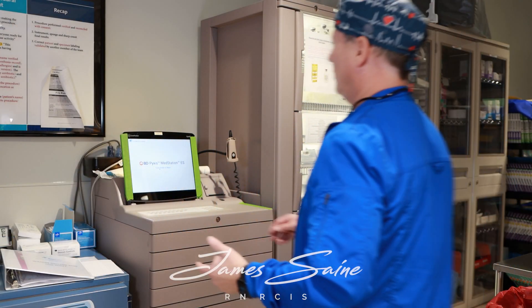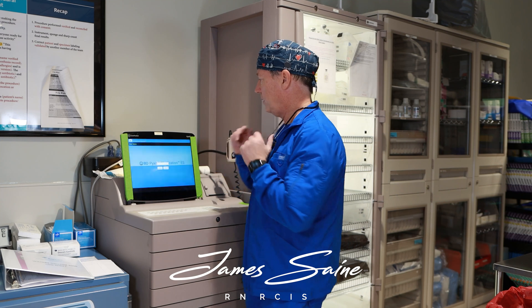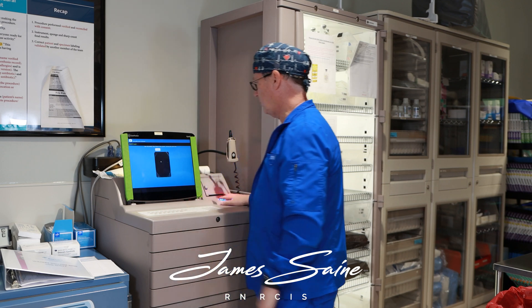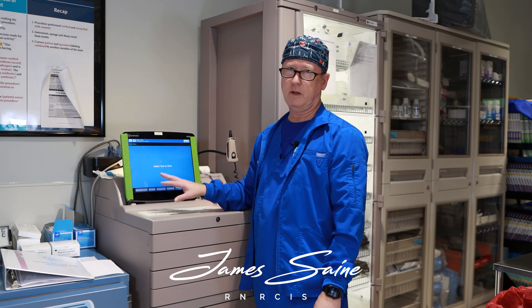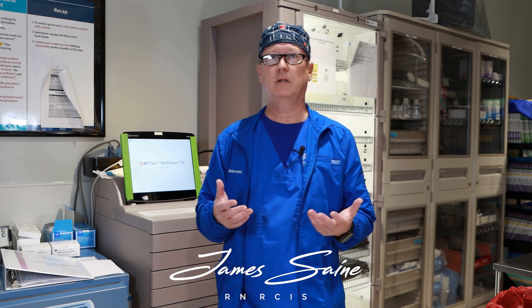Typically you have a subtype of machine that dispenses your medications. Here in this lab we have a Pixis machine. It's a touchscreen where you just log in with your password and fingerprint to have access. I'm not going to bring it up because it has patient information where you access medications to administer to the patients.